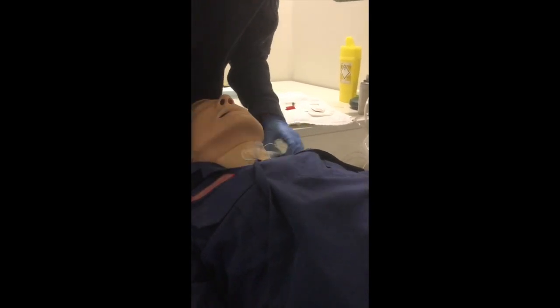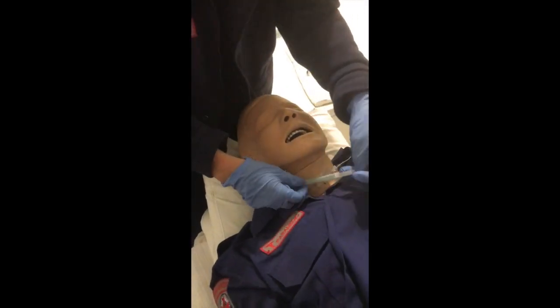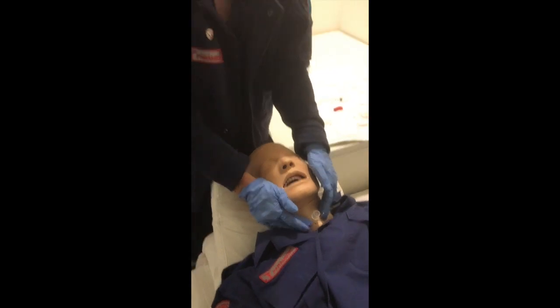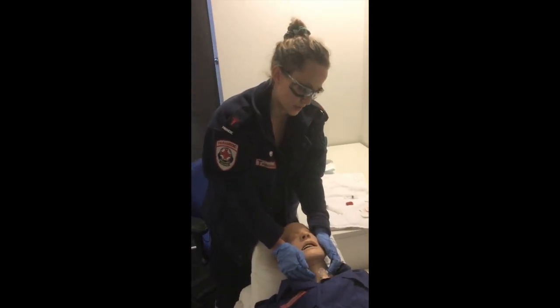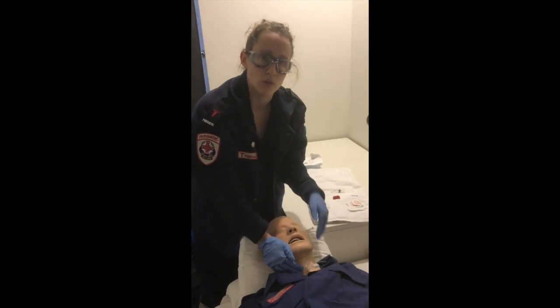We would then use our foam necktie here to secure this in place. Some post-procedure considerations may be ongoing sedation and or paralysis for this patient, as we obviously don't want them to be pulling this out. And obviously just maintaining the position of this and reconfirming constantly with end tidal and other adjuncts to make sure that the position doesn't change during any transport. And this patient will obviously need to go to a high acuity facility as well.